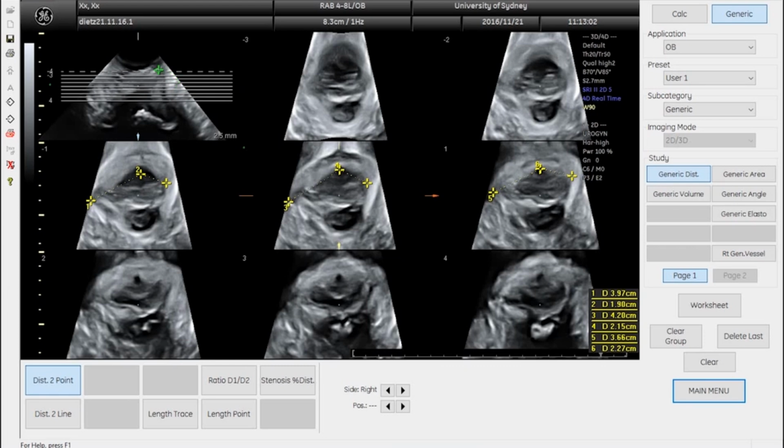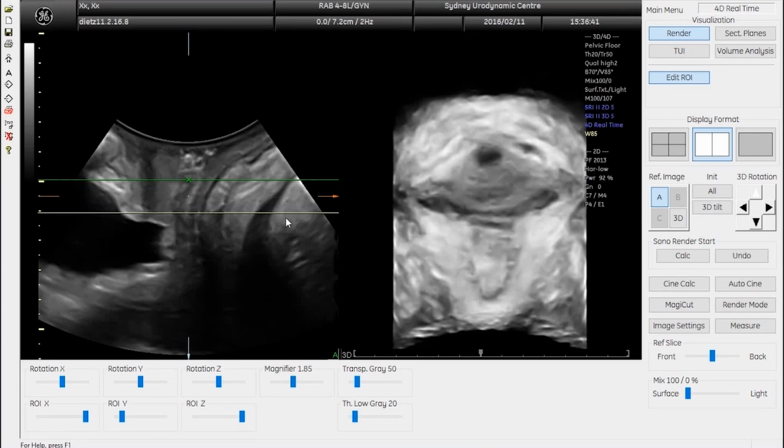Incidentally, in the coronal plane here at the top, you can see a normal muscle here on the patient's left. That's the puborectalis, and then the iliococcygeus slopes upwards like so, this inverted trumpet of the funnel of the pelvic floor. On the other side, there should be muscle here, and there's absolutely nothing. I can't see anything all the way up into the iliococcygeus, which again confirms that this is a full right-sided avulsion.